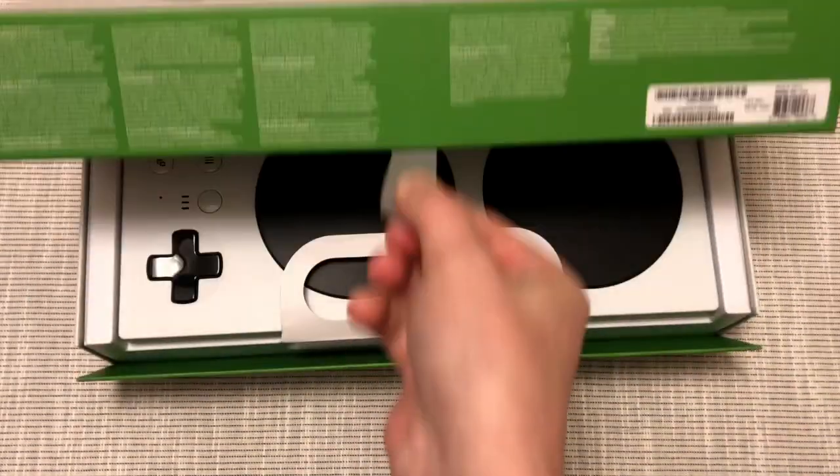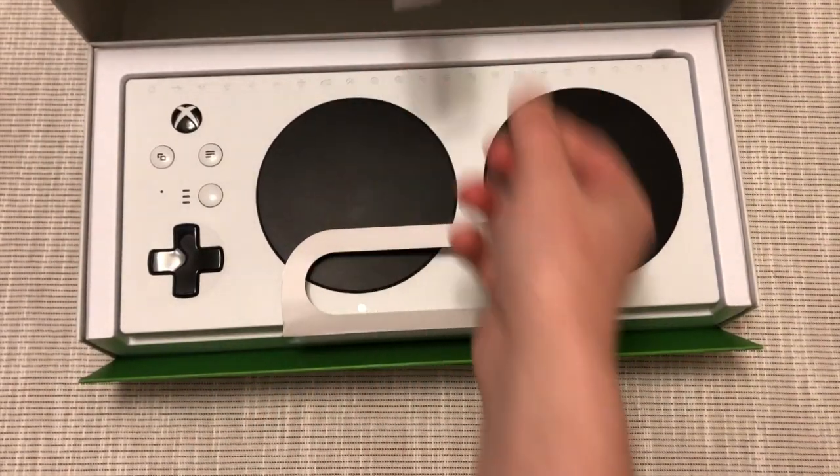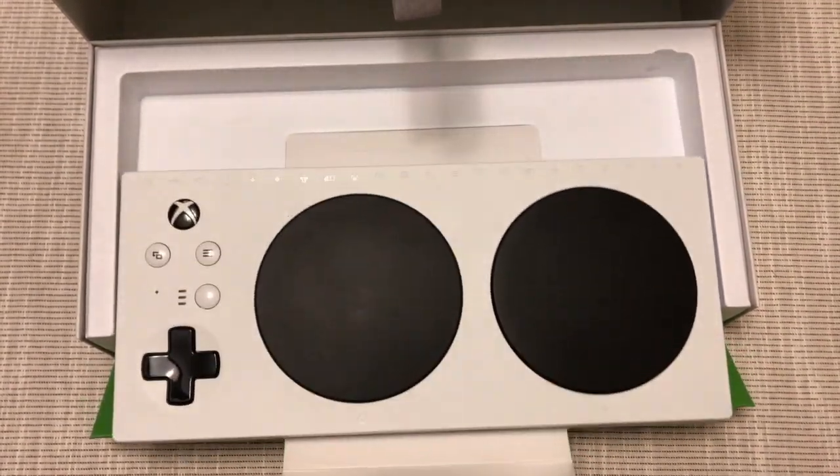To begin, it comes packaged with loops, tabs, and dividers, making it possible to open with one hand or limited by motor skills.